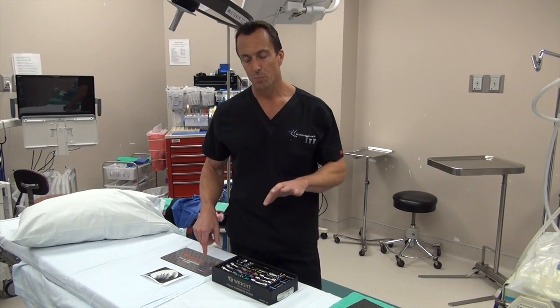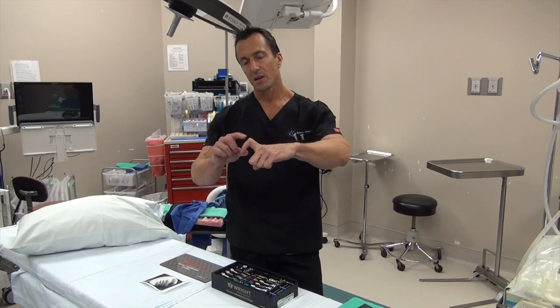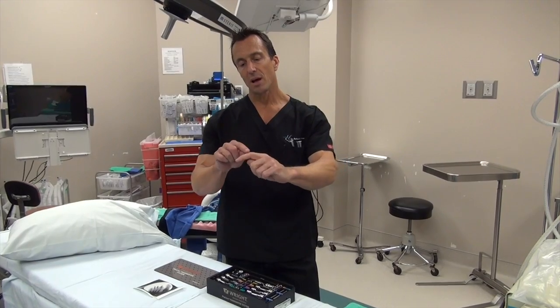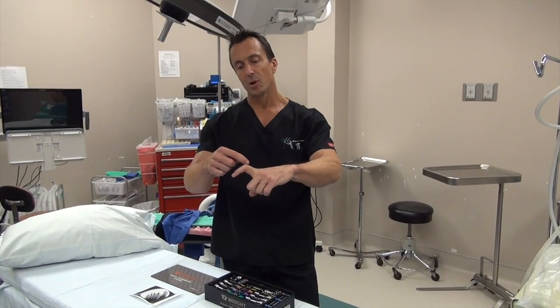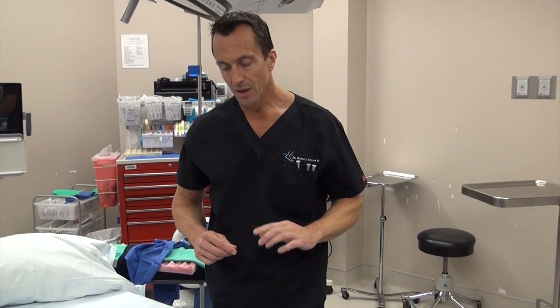Traditionally, the toes are pinned from end to end. The normal hammer toe that cocks up like this, it straightens pinned end to end traditionally. Now we have devices that go inside the bone marrow, or right down the central aspect of the toe, to keep it straight.